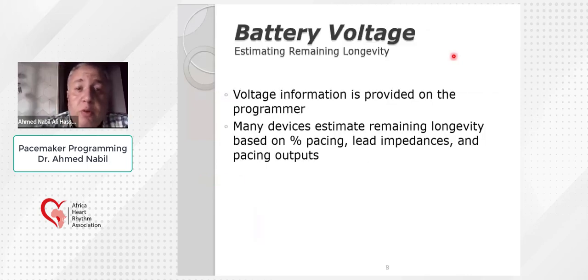Of course, battery voltage is very important to estimate the remaining longevity of the pacemaker. All pacemakers give the longevity, how much is left in the battery life. It can be given in years, or in years and months, and many devices estimate the remaining longevity based on the percentage of pacing, how much the pacemaker is continuously pacing.